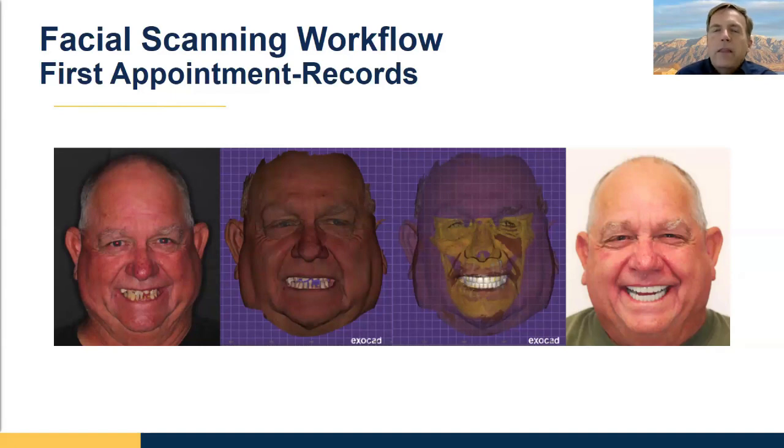One of the things you might not have thought of that's very different from working in the laboratory to working in the clinic is that you see the patient's face all the time. You see their nose, their chin, their cheeks. There's a lot that you can see, their tongue, that isn't present on a model. Most of the time in the laboratory, especially with full arch cases like a denture or an all-on-X, we're using a proxy for the patient's face to understand how their face works.